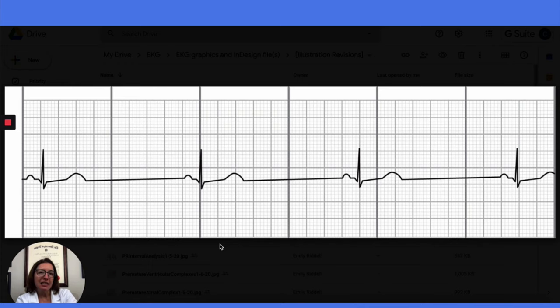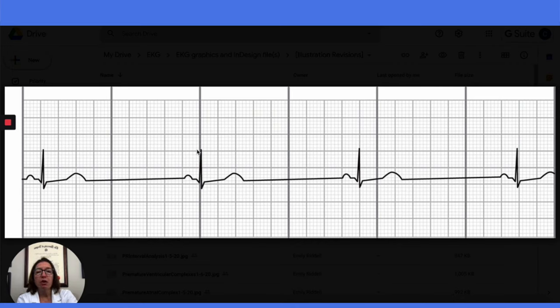We are looking at a sinus bradycardia strip. We can see that the heart rhythm is regular. If we get our calipers out and measure the distance between R-waves, those will be consistent across the strip. Same thing with the distance between P-waves — those will also be consistent across the strip.